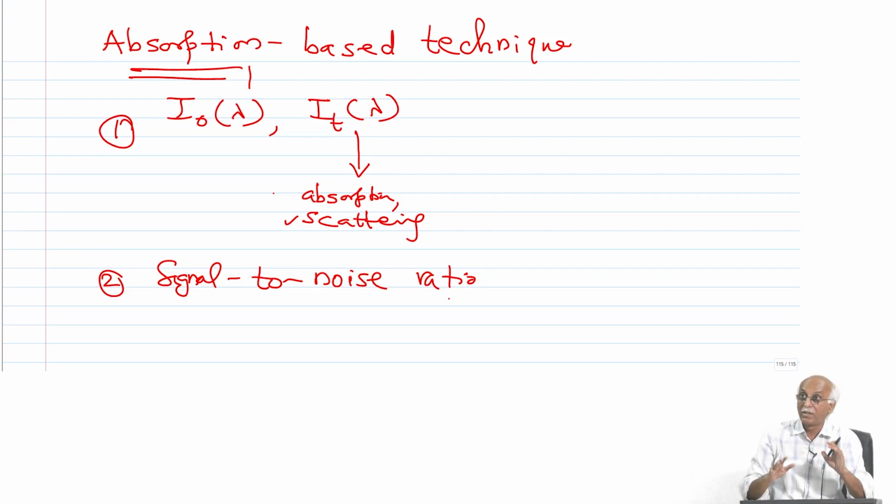But let us say this is a dark room and I switch on one LED and light is emitted. The detector will immediately detect that light, because the signal was 0, so the signal to noise ratio is quite large.